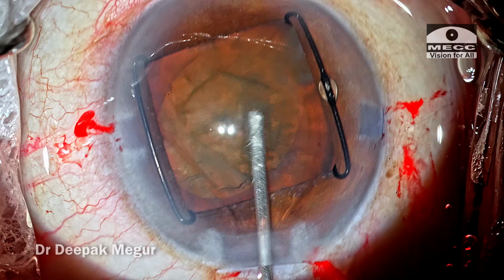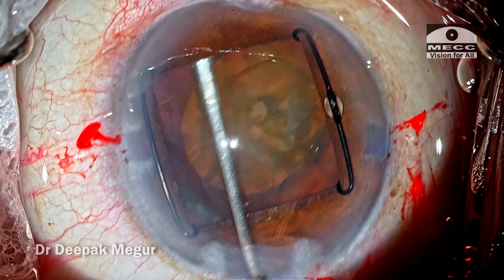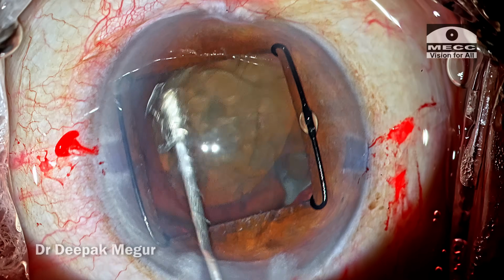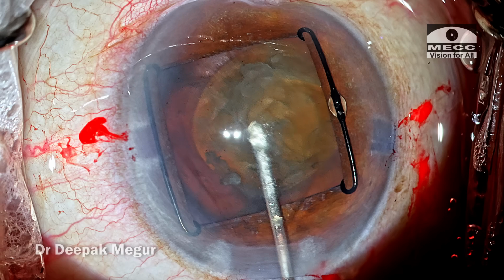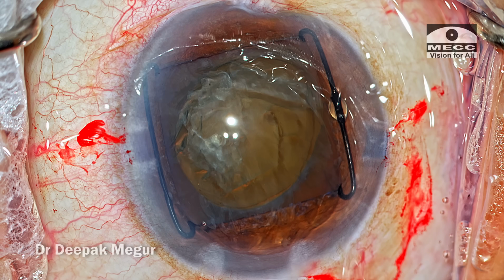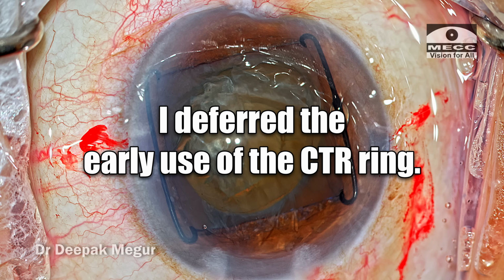So as I'm trying to move the nucleus, initially I feel that the bag also is moving along with it, but subsequent repeat hydrodissections ensure that the nucleus is now relatively free from its attachments to the bag. The nucleus is rotating and the bag is held steady. So this is a sign which confirms that I can now proceed with nucleus management, and because the nucleus is relatively free, the CTR insertion would be done later.